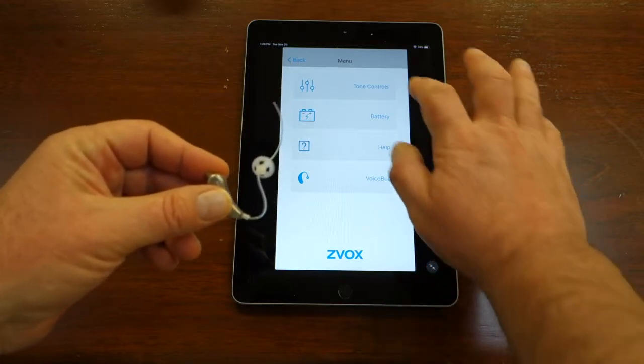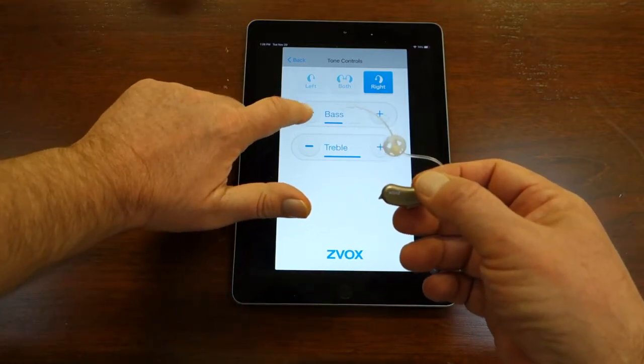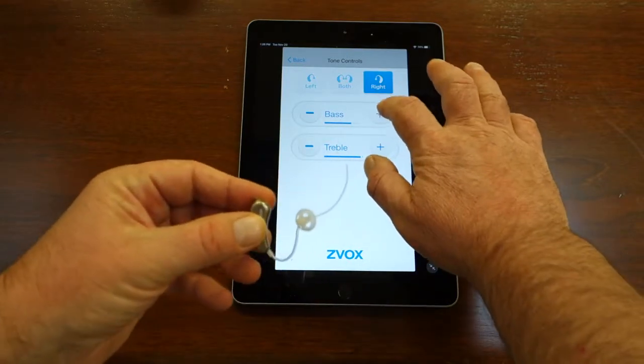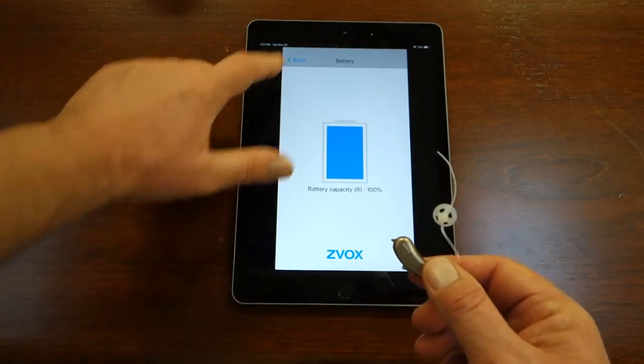To change bass or treble, go to the Tone Control page where you can increase or decrease bass and treble for either VoiceBud, or for both VoiceBuds at the same time. If you go to Battery Life, you will see icons for each VoiceBud battery showing how much power is remaining.